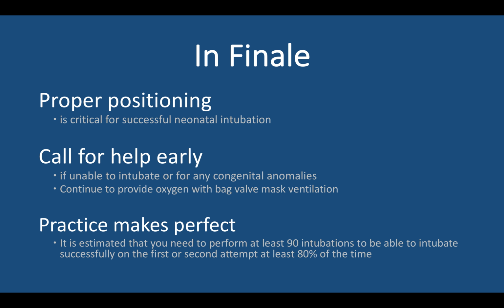Finally, proper positioning is critical to any procedure, especially a successful neonatal intubation. Call for help early. If there are any congenital abnormalities in the patient, don't try to do this alone or by yourself. Call someone immediately. Remember, you can always ambu bag an infant as long as you see their chest rising and their oxygen sats staying up.